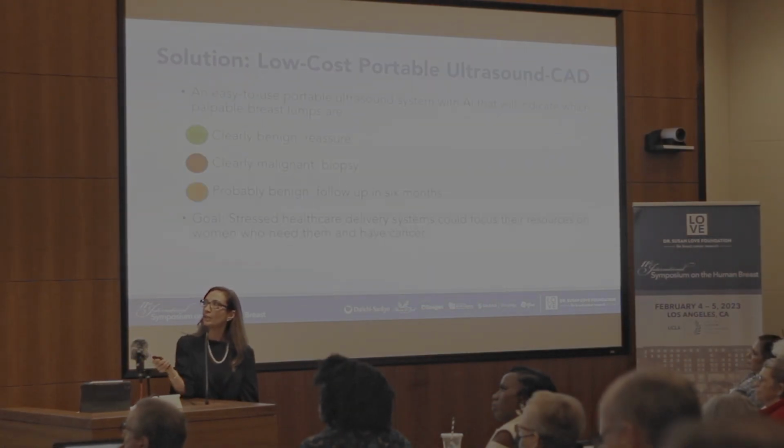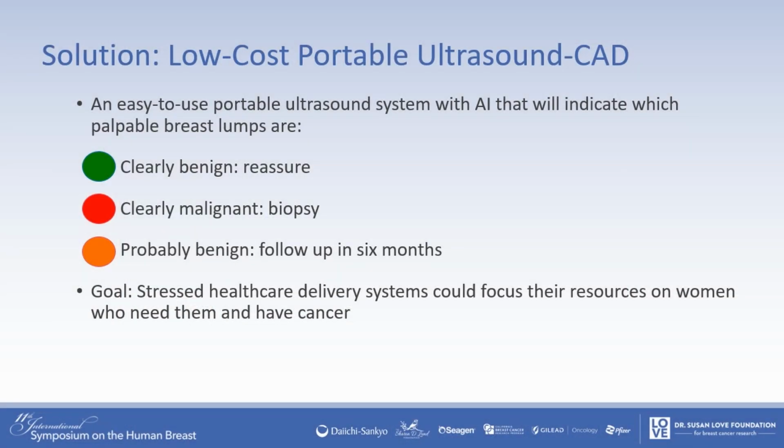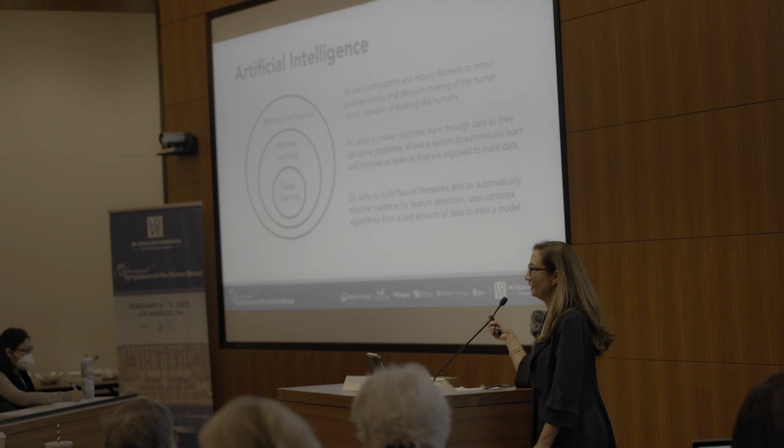So let's back up. Basically, an easy-to-use portable ultrasound system. Then you put the image in with the AI. The AI says, okay, clearly benign, clearly malignant, or probably benign. So AI is a little tricky.